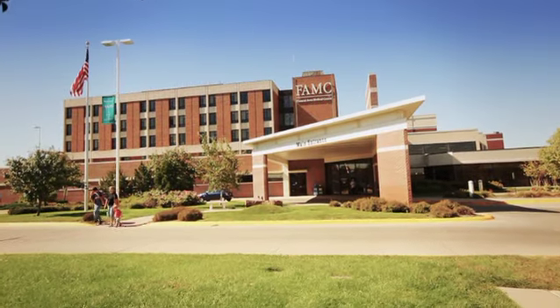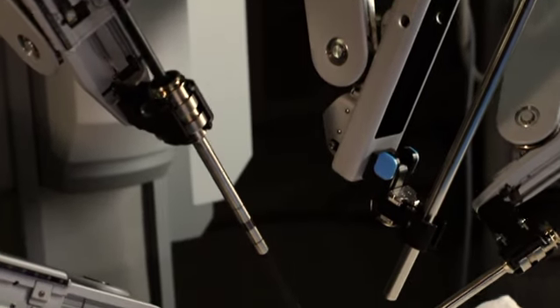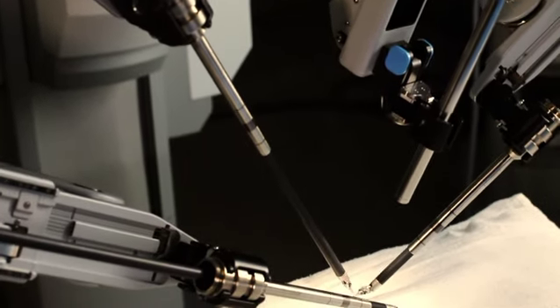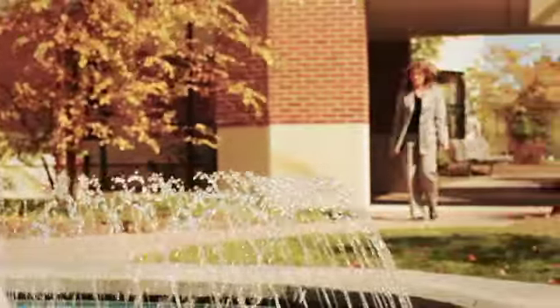Surgeons on the medical staff at Fremont Area Medical Center have been performing surgeries with the aid of the da Vinci robotic surgical system since the summer of 2004. For patients, this usually means fewer side effects and quicker recovery.